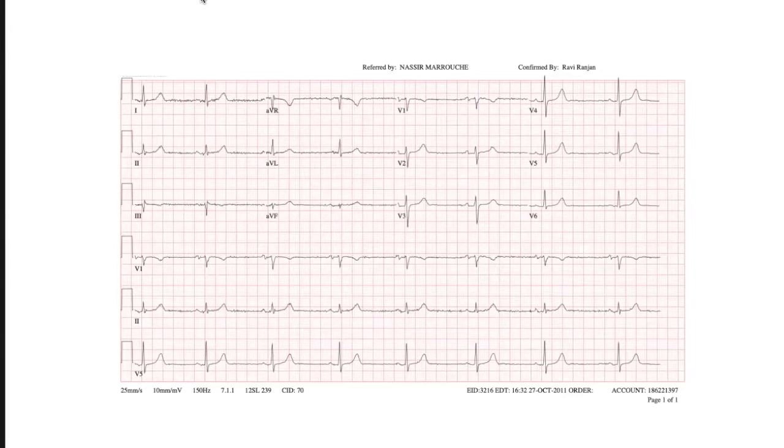But while you guys are figuring it out, sometimes we've got 2 regions, right? We've got the short signals, and we've got the long signals. And they serve 2 different purposes, otherwise they wouldn't be there. The short signals give us a snapshot of all the rhythms, all the morphologies. But then the long signals give us what it's doing over time. So calculating heart rate based off of one signal is a good starting point, but once you have the heart rate in your head, you want to glance down at the rhythm strip and ask, is it constant or is it consistent?